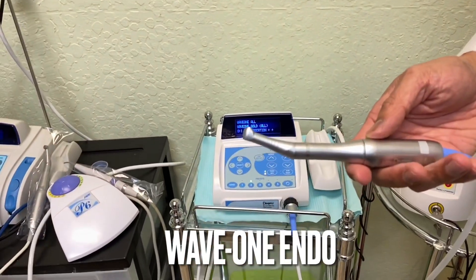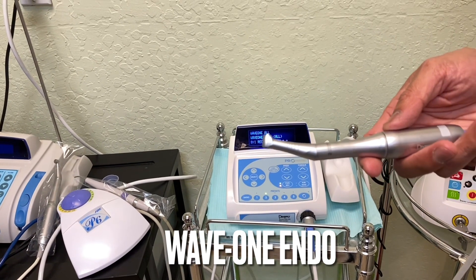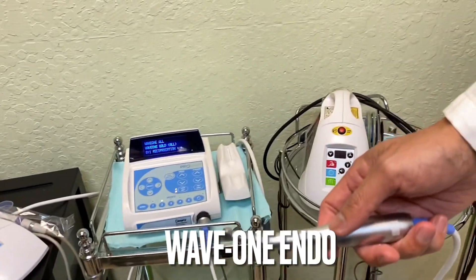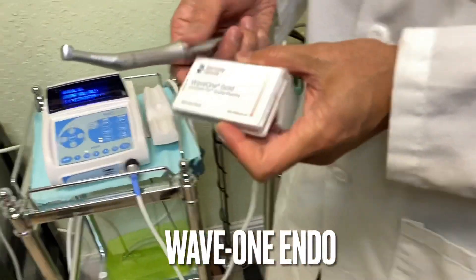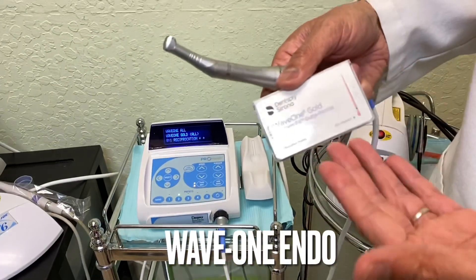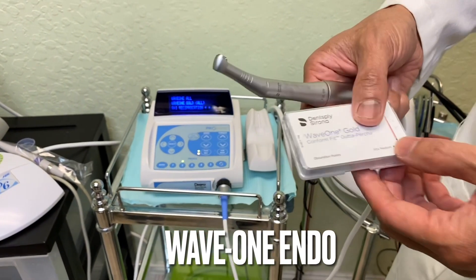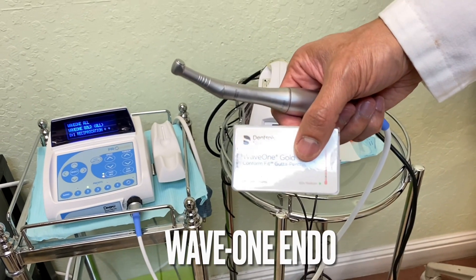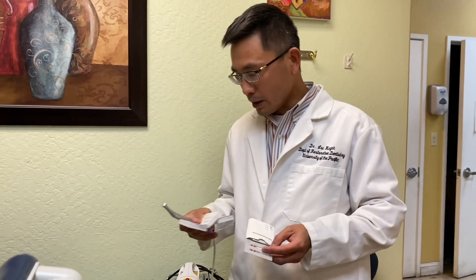I'll show you some of the X-rays that I've done so you can see the clinical cases and how they turned out amazingly. Wave One is very simple too — they only have a couple of things to use. One is the primary file. They have different sizes, but the primary size is something I use for most of my cases.